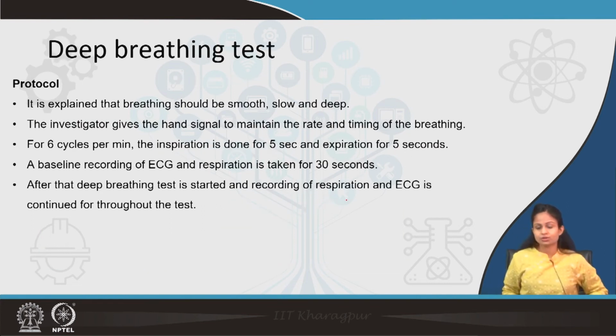Next, coming to the slow or deep breathing test. In the slow or deep breathing test, the breathing should be smooth, slow and deep. Most of us have seen this in yogic breathing or pranayama, where the breathing is very slow and deep, not fast. The investigator should give a hand signal to maintain the rate and timing of the breathing.